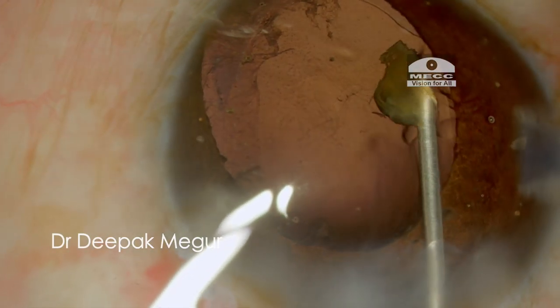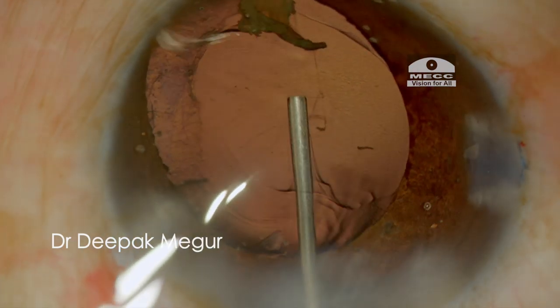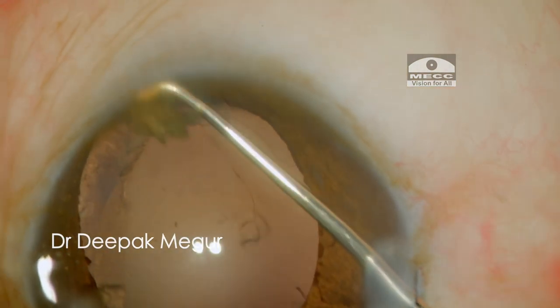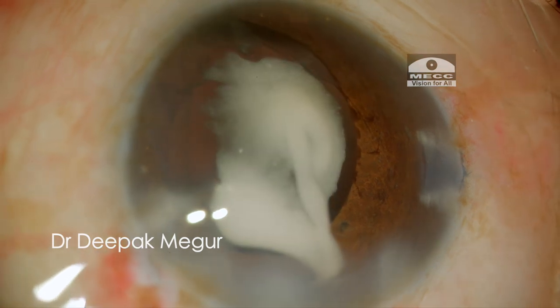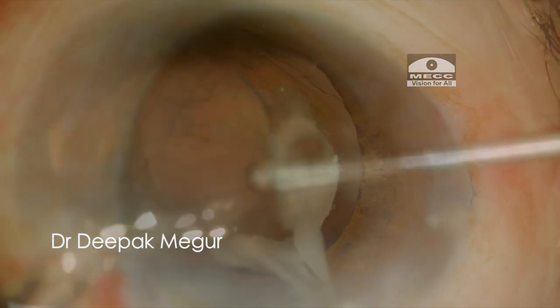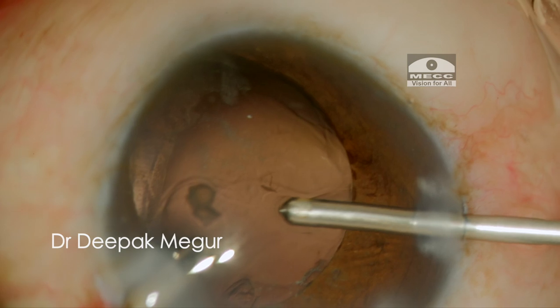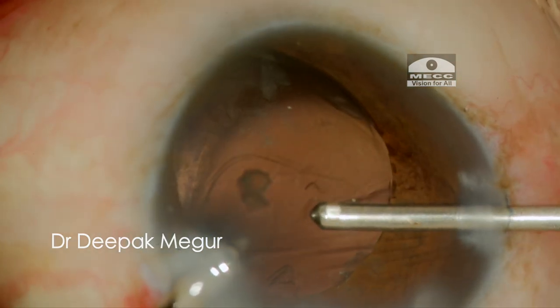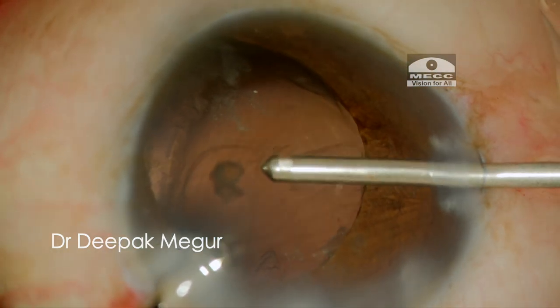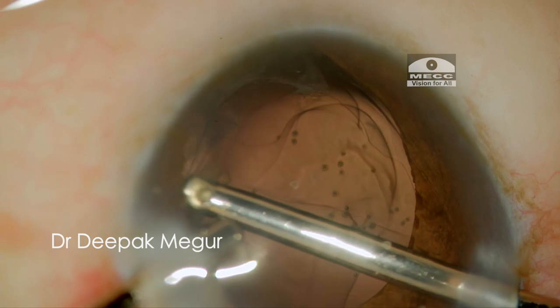Viscoat is again introduced to ensure that the PC tear and the vitreous is tamponated adequately. The remaining small fragment is visco-expressed. I can see a few vitreous fibres at the edge of the PC tear, and diluted triamcinolone acetonide is used to confirm it. Now it's time to proceed with anterior vitrectomy. Care is taken that the bottle height is kept very low so that irrigation is quite slow and gentle, which ensures that the vitrectomy could be done without enlarging the posterior capsule tear. Once the limited anterior vitrectomy is completed, the remaining cortex needs to be dealt with.